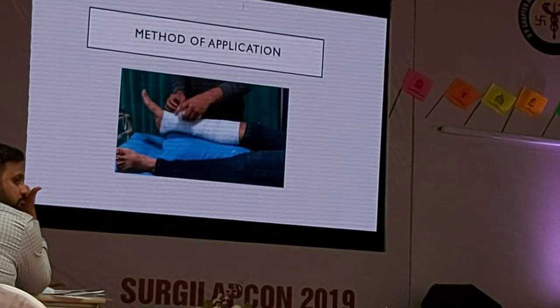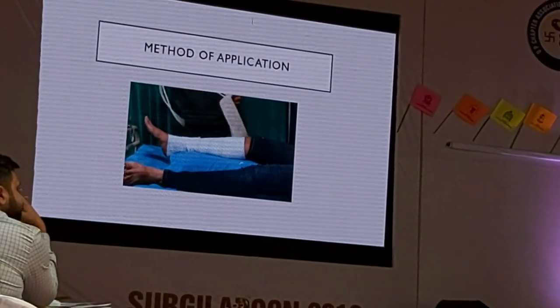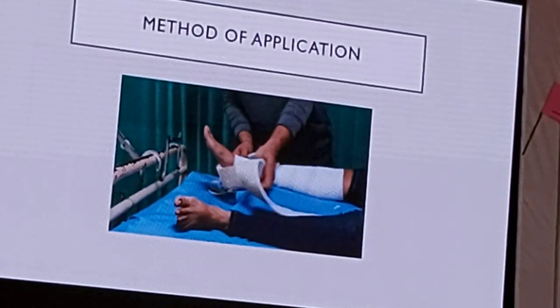Once you have applied the soft roll, you will take a traction kit and apply it at the foot end. The foot end of the traction kit is made with a sponge so as to allow flexion and extension at the ankle joint.